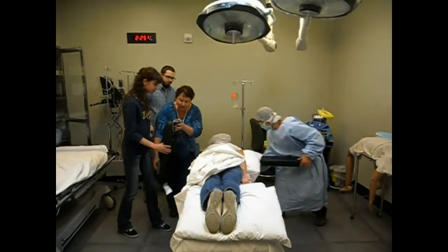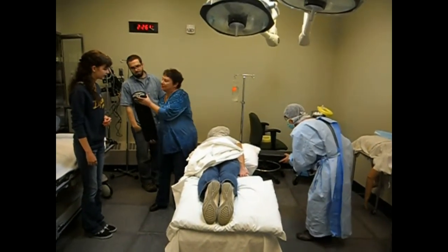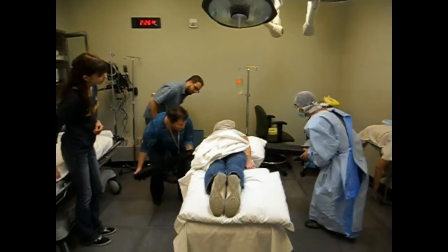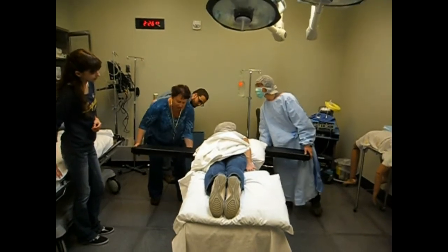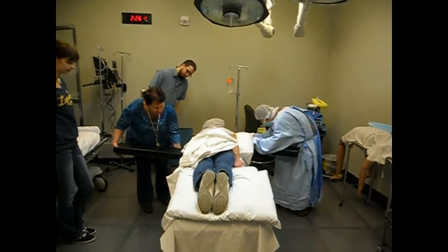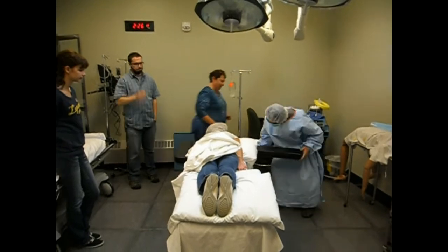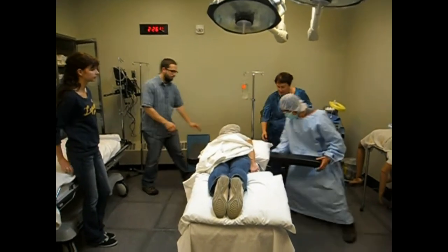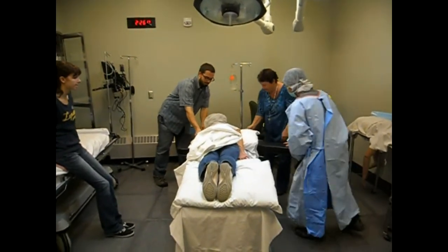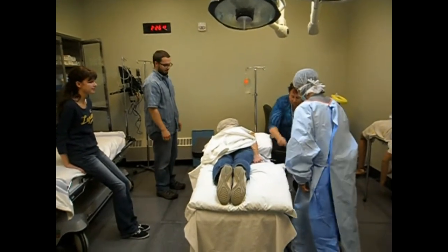Okay. You guys got to practice this too because these are hard and this you have to have back and you have to come way down, way over and catch it and then test it. Now what we want to do is slide it down some because we want this to end up like this. You get it? Did you get it? Looks like you did. Always test it. All right, and now bring that. Let's put the Foley down. And bring it up to the head now.